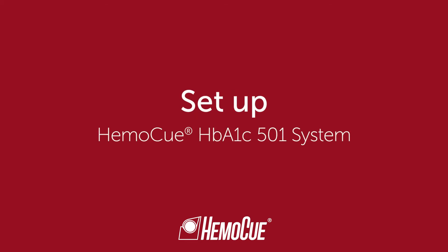Welcome to the HemoCue HbA1c 501 System Instruction for Use video. In this video, you will learn how to start up the analyzer.